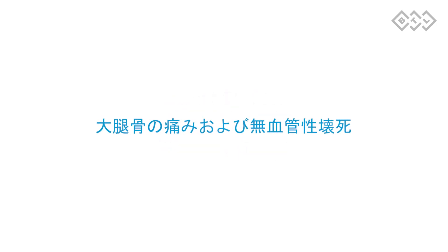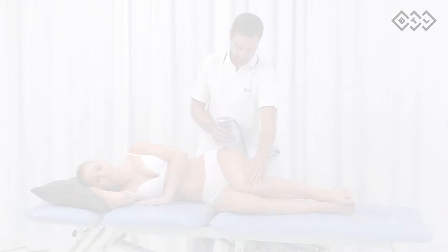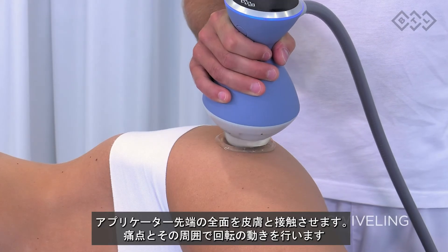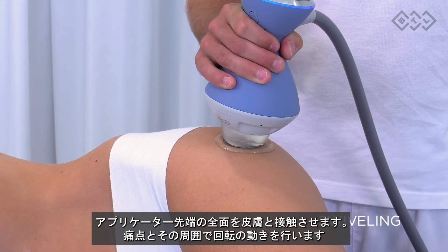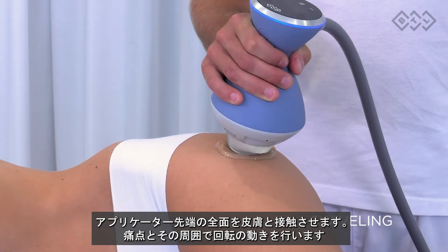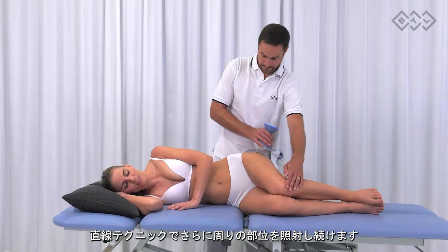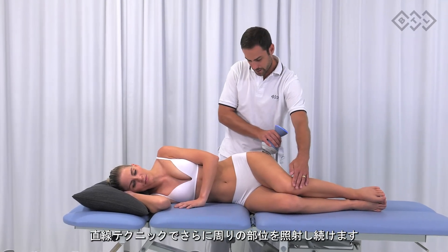Hip pain and avascular necrosis. The legs should be in a relaxed and neutral position. Apply full contact therapy and perform swiveling movements in the most painful spot and its proximity. You can continue with the painting technique to treat the surrounding area.